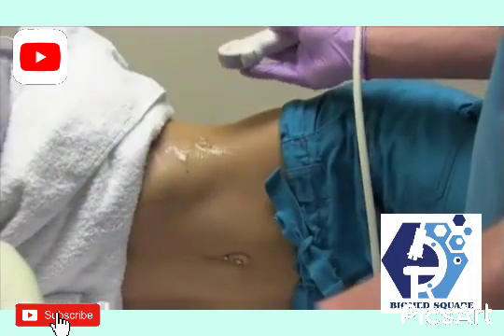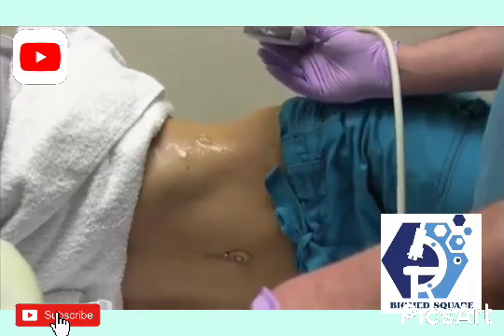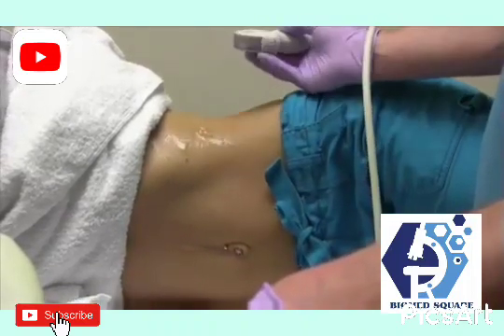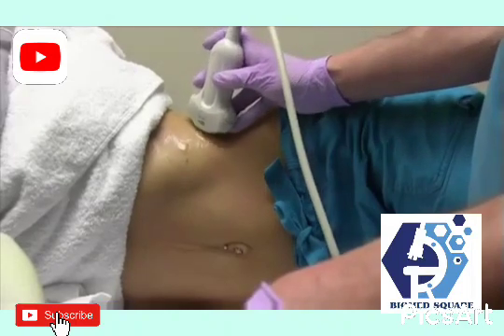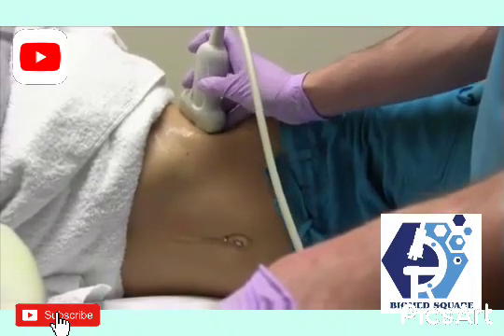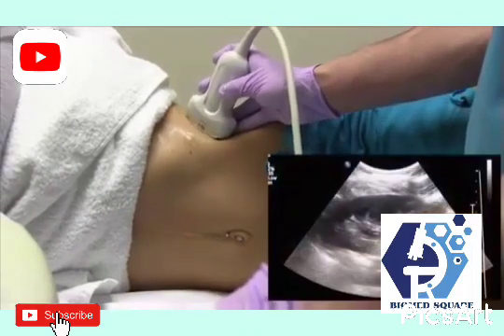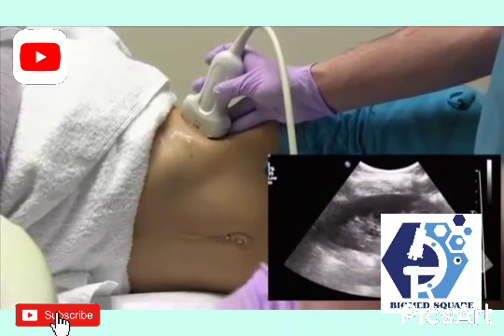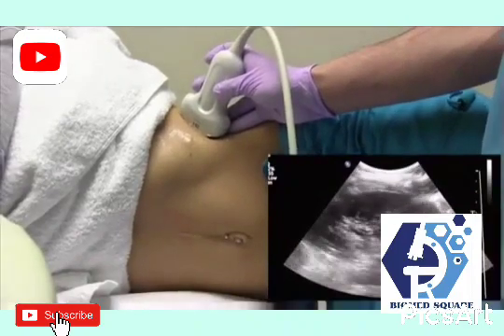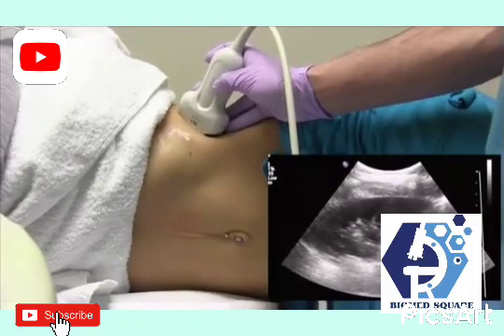To image the left kidney, we usually have the patient turn up into a right decub, so they're facing you, and usually you're going to be below the rib spaces here. And the important thing to remember for the kidneys is the upper pole of the kidney is going to be slightly more posterior.